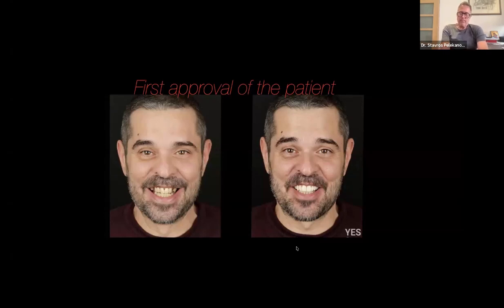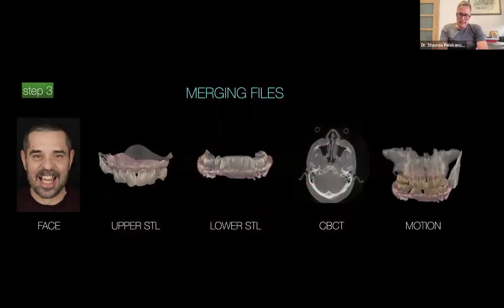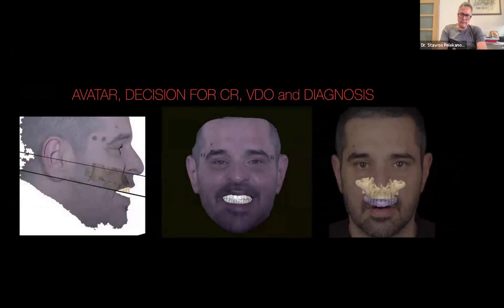And at the same time, we define, as we say, the incisal curve and the tooth proportions. So step number 3 is merging the files. So we are merging the face, the upper STL, the lower STL, the CBCT, and the motion. And in that way, we are creating the digital avatar of the patient.